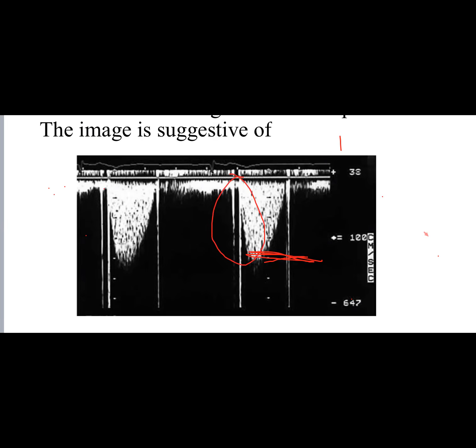This metallic flap, or the metallic imprint, during the opening, how does it open? And how does it close? You see two lines, right? When they close, they close with one line, but they open with two lines. They are supposed to open and close with one line because I have two discs, and they are synchronous.